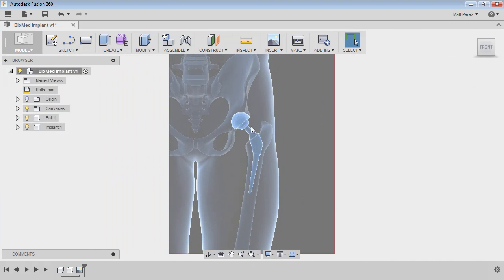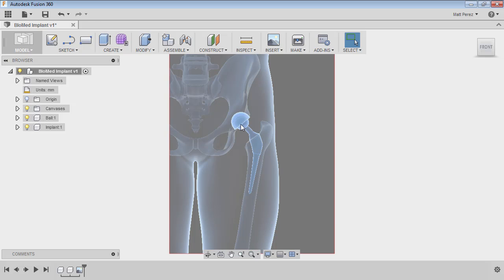And then I'm going to go ahead and redock the browser off to the left side and fit to view. So now we have a very good view of a current x-rayed implant, very similar to the shape that we're going to be approaching. But again, it's a little bit different than our end goal. But we now have the shape, the ball and socket, and the tapered section of this as a good reference.